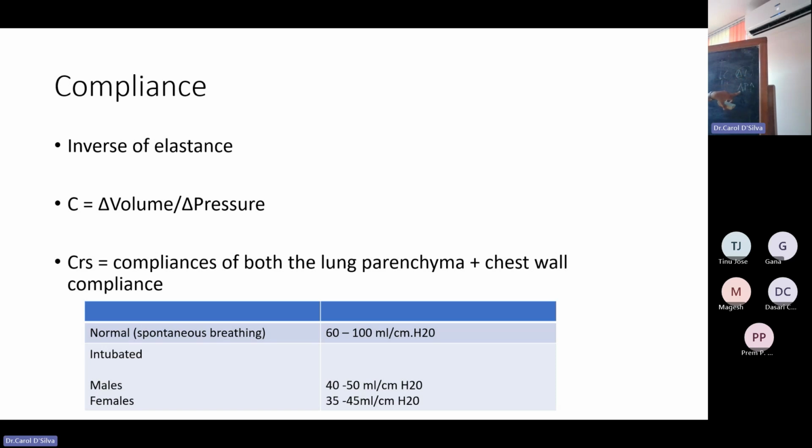Okay, so if I was keeping a pressure difference of 10 and I was getting a tidal volume of 500, if suddenly for some reason the compliance of the lungs reduces, what is going to happen? For the same 10 pressure support, what's going to happen to my tidal volume? It's going to reduce. And then your machine will start alarming that the tidal volume is less.